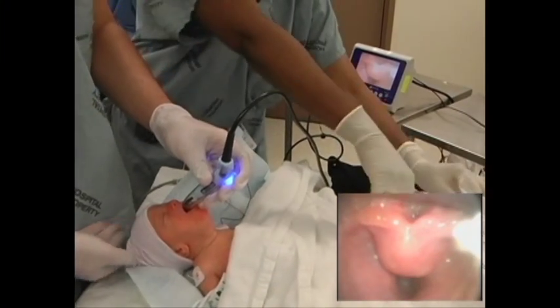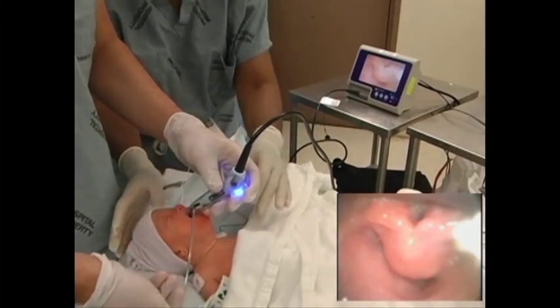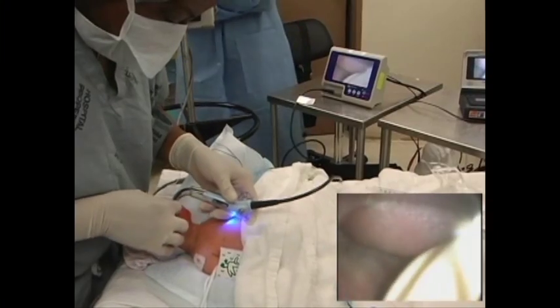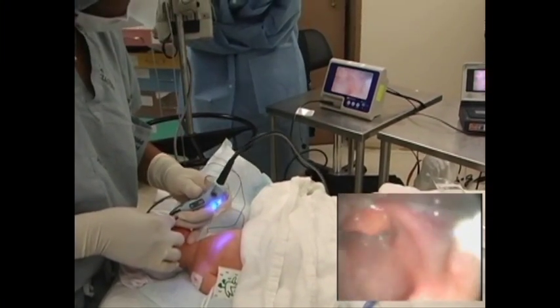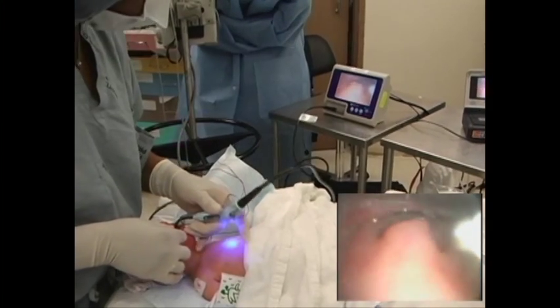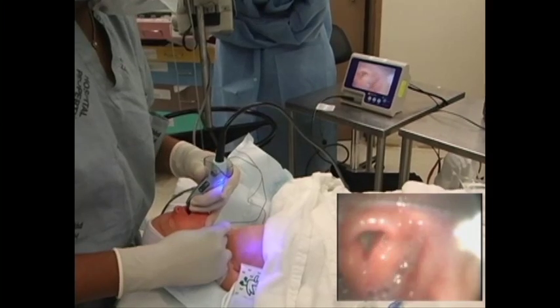In this case, the view of the esophagus is a good indicator that the blade has been inserted too deep. When this occurs, backing out the laryngoscope approximately one to one and a half centimeters should improve the view and enable successful advancement of the endotracheal tube.